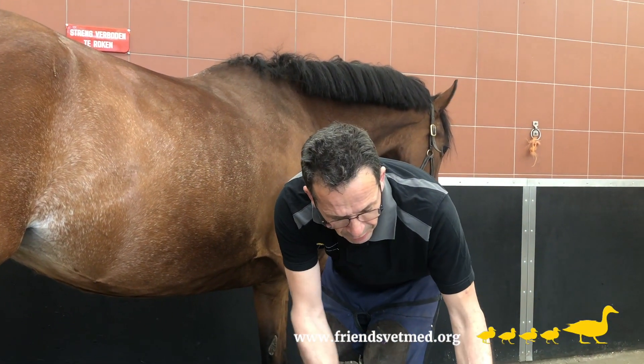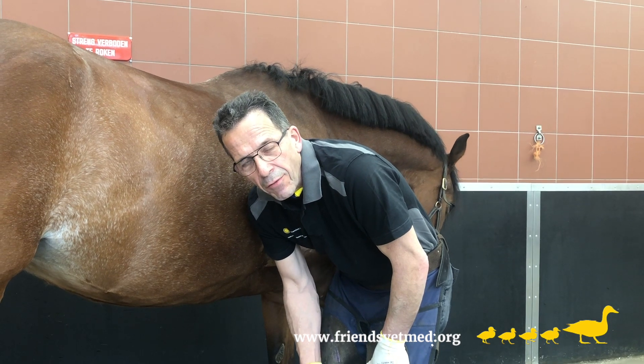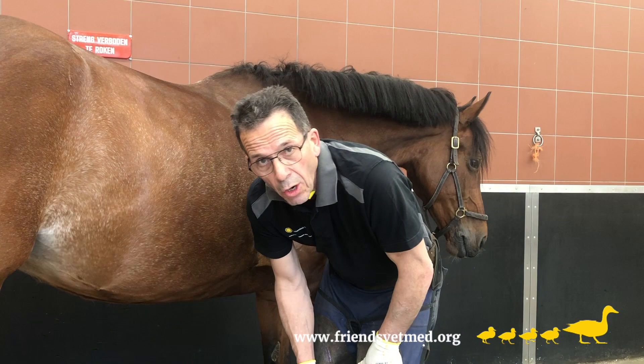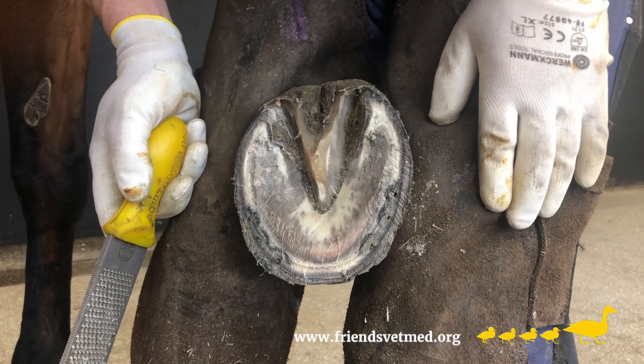This horse hadn't been shod in a while but had been kept barefoot. After a while the horse started going lame. It showed symptoms of stringhalt in both hind legs and was becoming increasingly difficult to handle. You can still see some of the bruising here from the time the horse was kept barefoot.